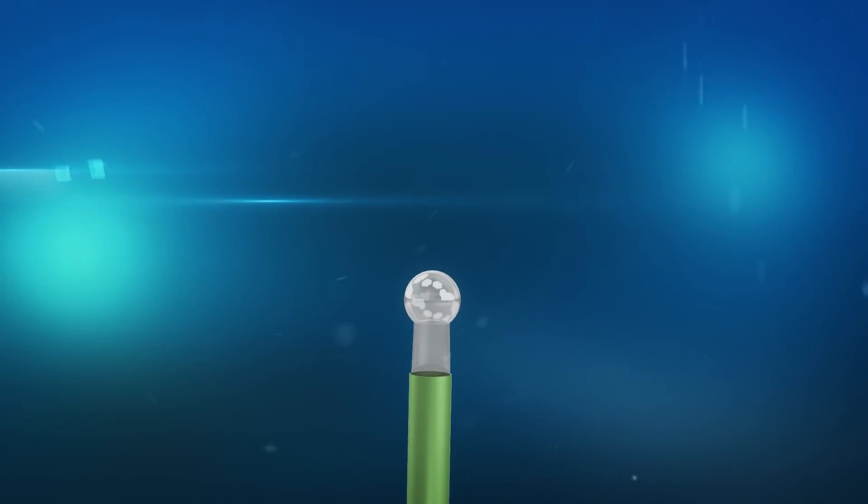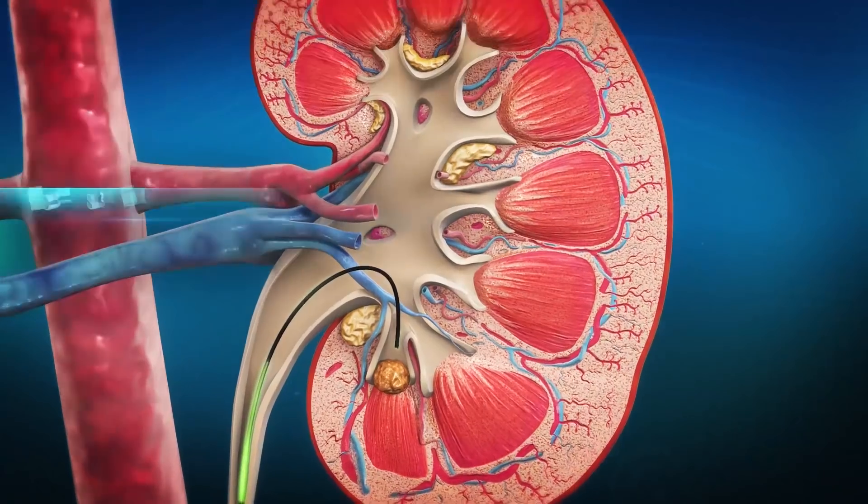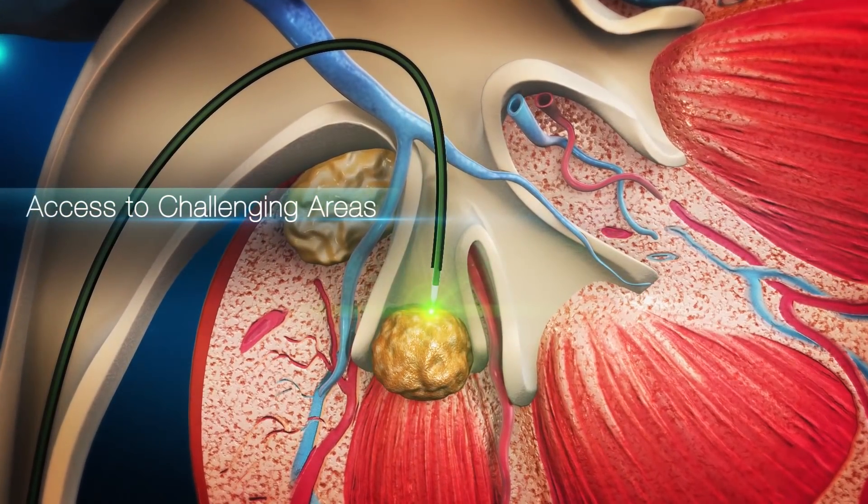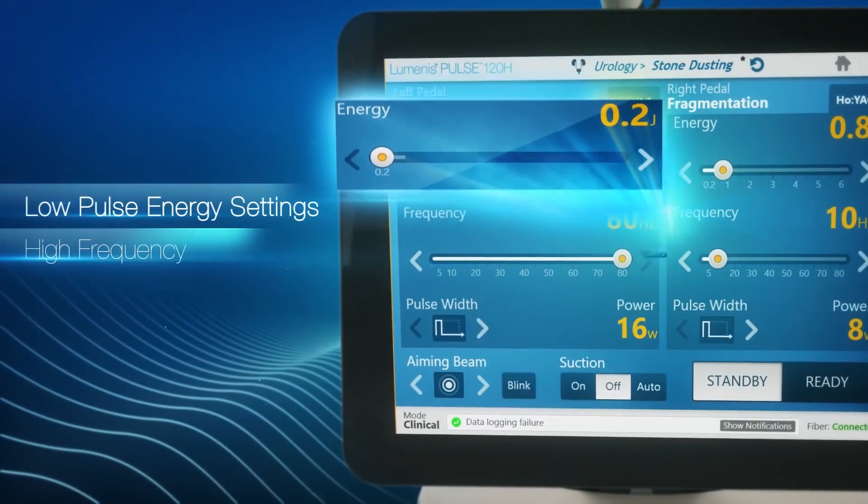The unique rounded tip of the fiber reduces the chances of inadvertent damage to the scope and therefore saves cost. It can effectively pass through a fully deflected ureteroscope in one single step, reducing procedure time.